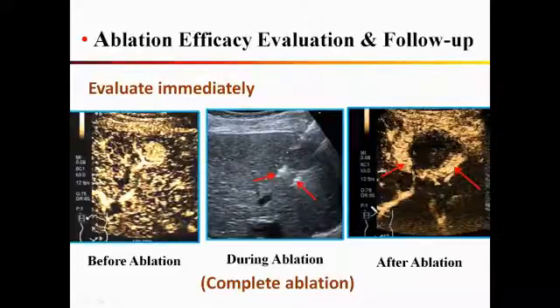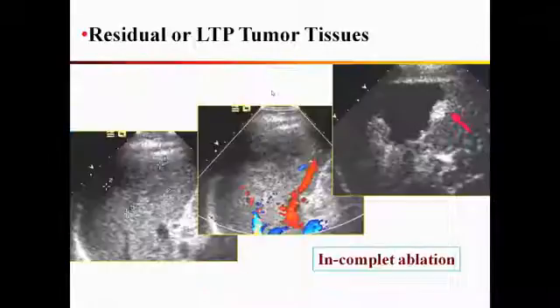After ablation, immediately after injecting the contrast agent, we can see a big area covering the whole tumor area. So it's a complete ablation.